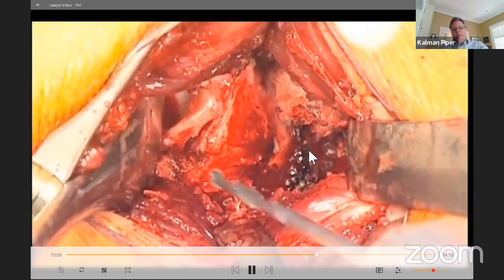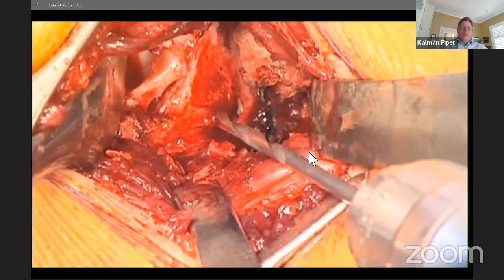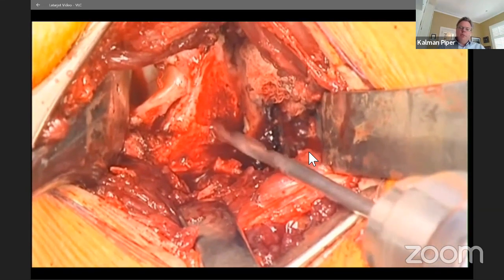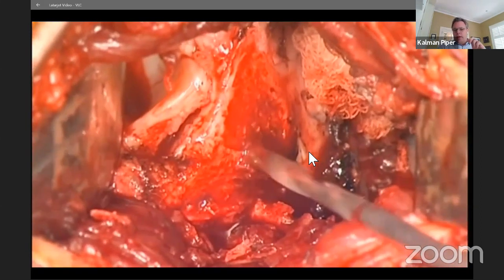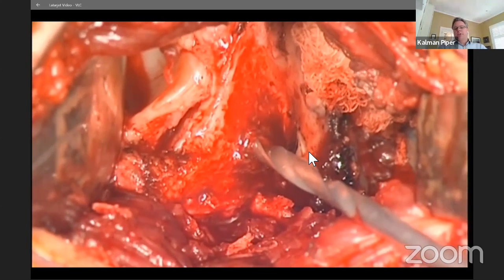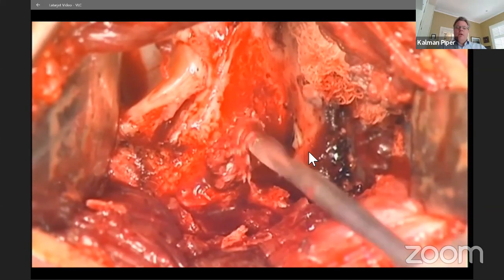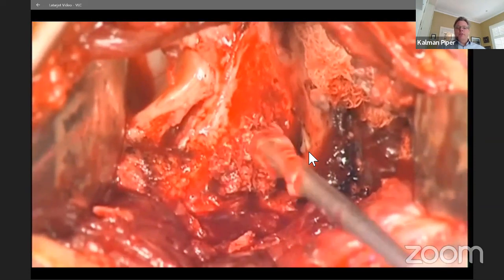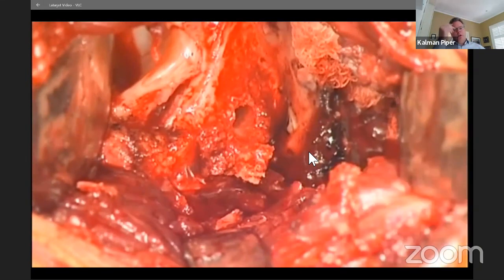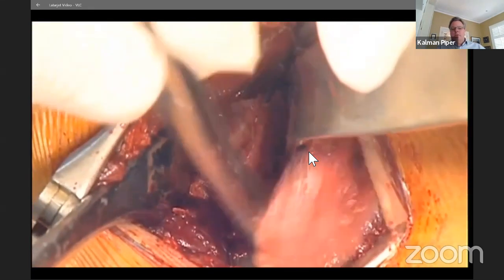One of the mistakes I commonly see with people doing the Latarjet procedure is, like the inferior anchor on a labral repair, they're trying to get it as low on the glenoid as possible, but that's actually not how a Latarjet works. So the Latarjet graft should be at about the 5 o'clock position to the 3 o'clock position, even a little higher. The big mistake you can make with the Latarjet procedure is to place the graft too low, and then the shoulder, if it's going to redislocate, will dislocate over the top of the graft. So you want to place the graft a little bit higher on the glenoid and rely on the sling effect, the conjoint tendon meshing with the lower border of the subscapularis tendon, to provide the inferior stability.